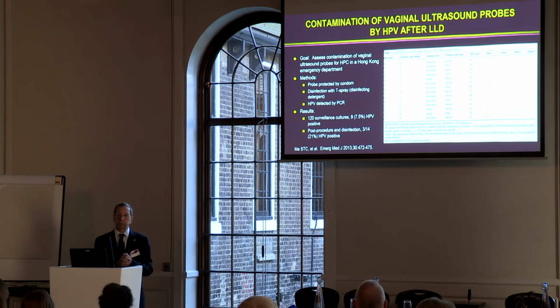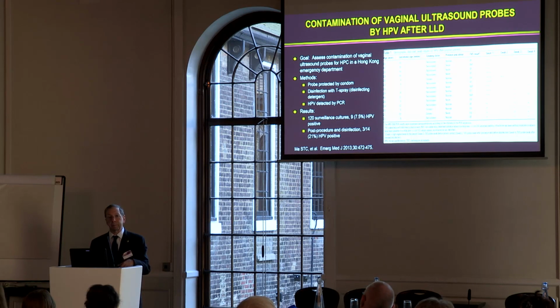The problem with probe covers is twofold. One, they often fail. And the second problem is just in the process of removing them, if you touch through your hands or the probe itself, the cover, you can contaminate the underlying probe. So while I certainly recommend their use when it's possible because they do decrease the bioburden on the probe itself, they do not allow, at least in the United States, the guideline explicitly states that a probe cover plus low-level disinfection is inadequate. Even with the probe cover, high-level disinfection is recommended for disinfecting semi-critical probes, not probes used on intact skin, but semi-critical probes.